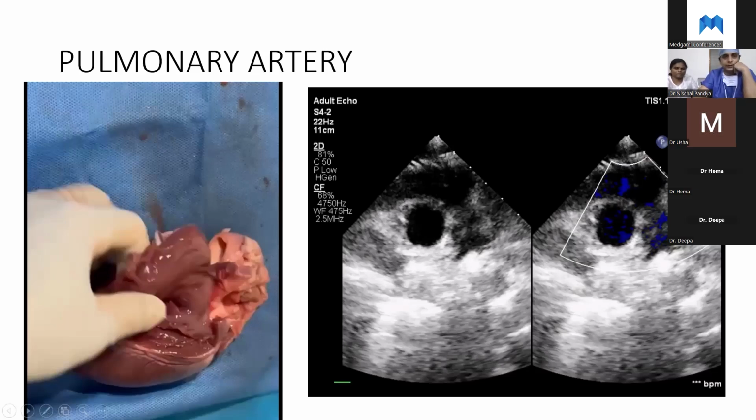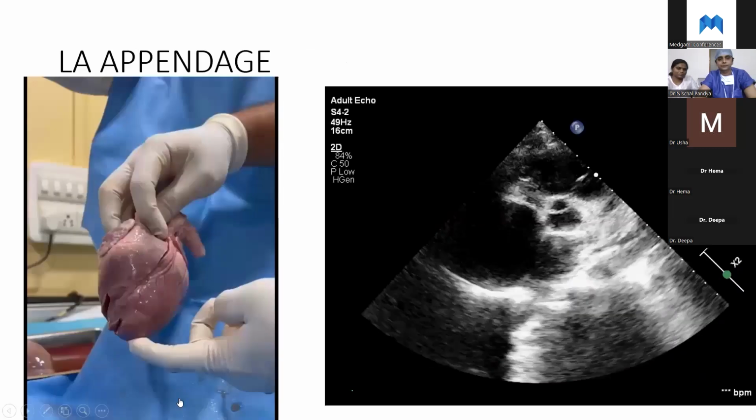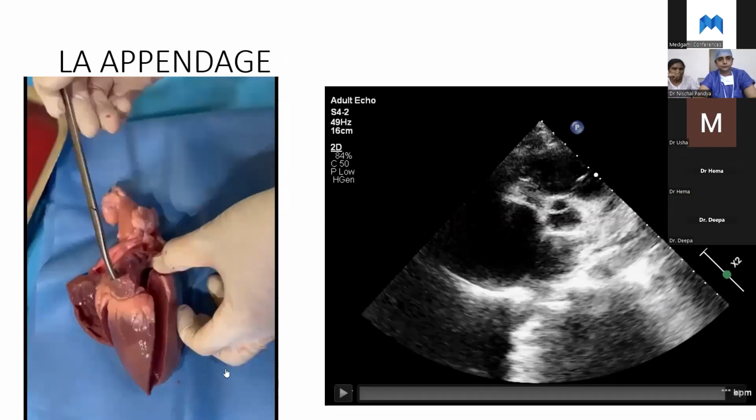So, yeah, the next one here, let's see. LA. Open the LA and see. Going into the LA appendage.